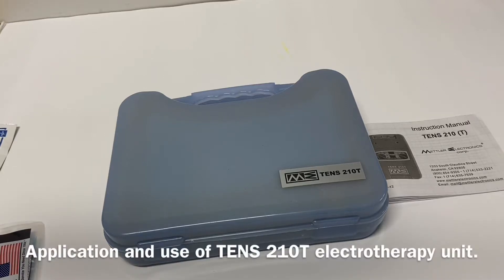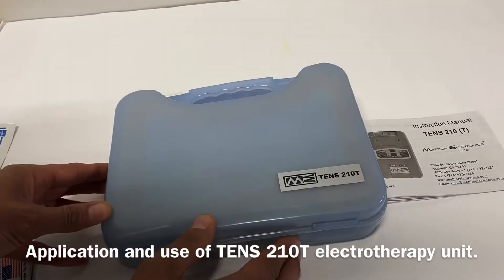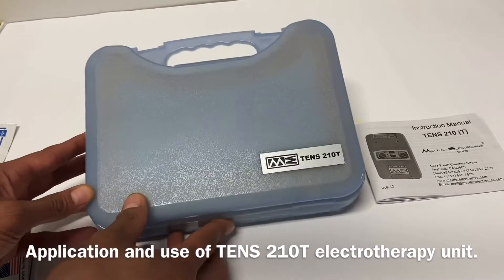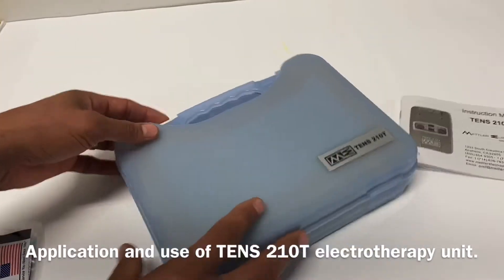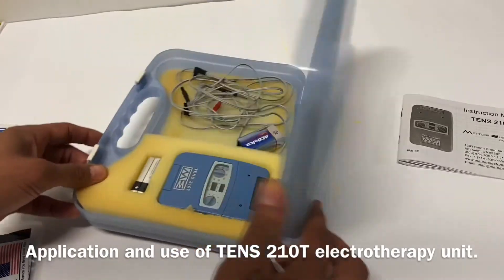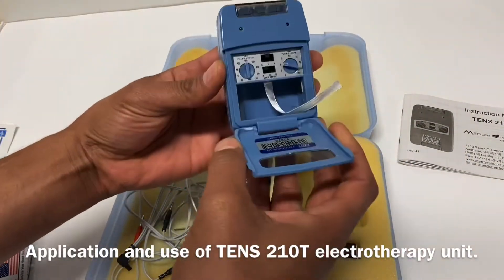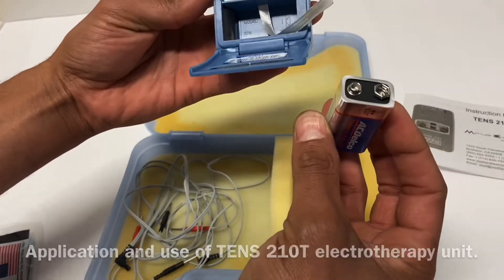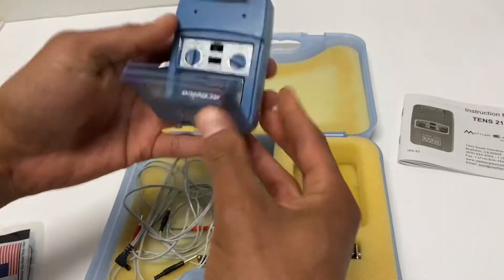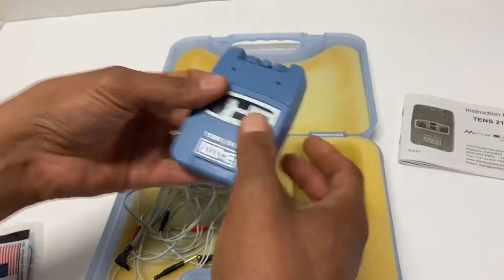We've got an instructional video here trying to teach you how to use the TENS unit. This specifically is the TENS 210T unit — they're all fairly similar. We'll open this one up; the battery goes in here, nine-volt.